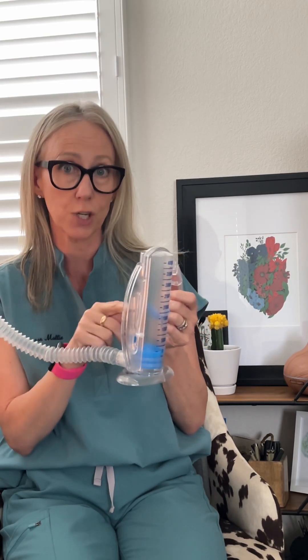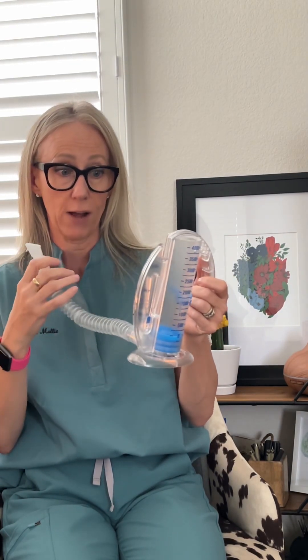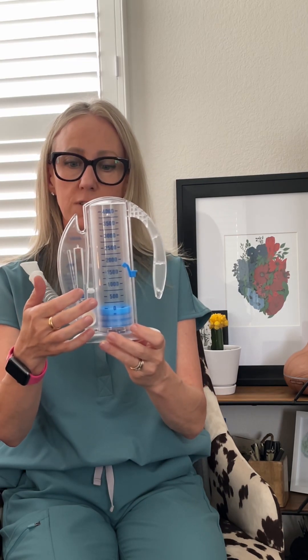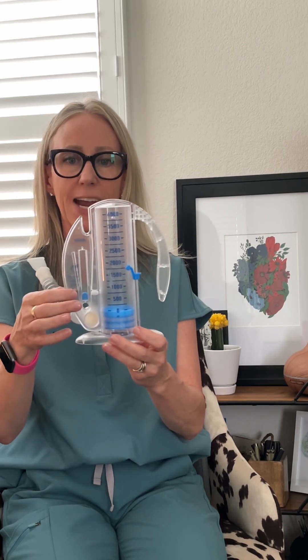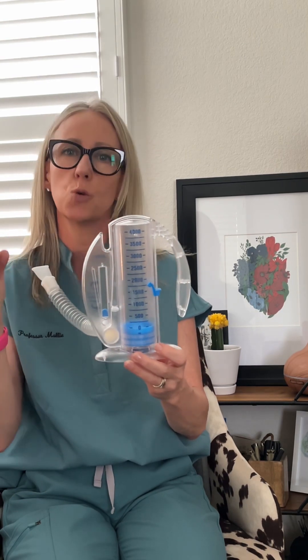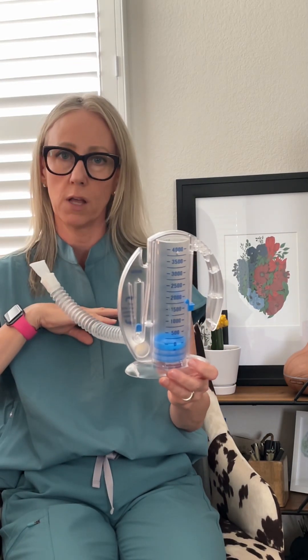It's important to know how to teach patients to use this correctly. You don't blow into it — you inhale. You need to get a good seal around your mouth, and it's not about how high you raise it; it's about the technique — keeping this little toggle in between the bracket. You may have a smiley face or an arrow on your spirometer, but that is the key. You want a slow, deep breath in; if you do it too fast, you'll only fill the top part of your lungs and the lower alveoli won't expand.